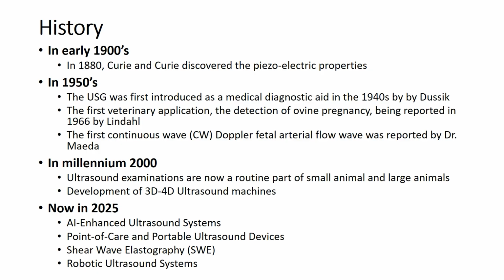Nowadays, in 2025, the ultrasound machine comes with artificial intelligence enabled. Some portable ultrasound devices are also available which we can attach to mobile phones.